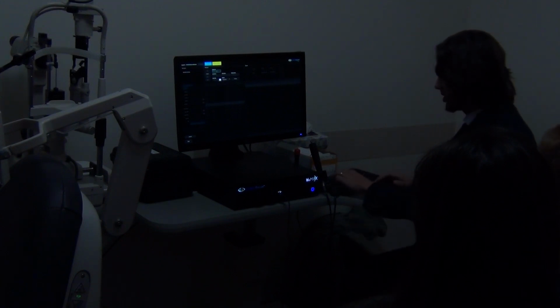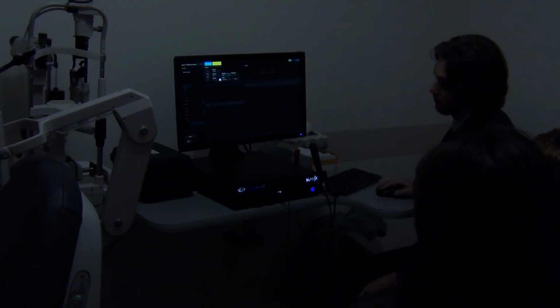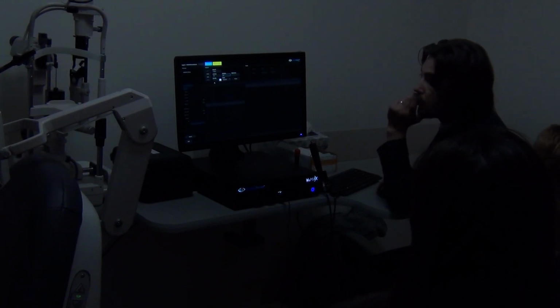We'll fill out the patient's ID, 1, 2, 3, 4, 5, let's say. Last name. First name. The rest of the fields is up to you if you'd like to fill out or not, but these first three are most recommended ones. And you click enter. Is there any value in putting the K values in for UBMs?